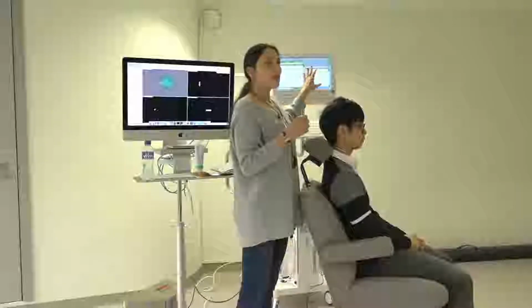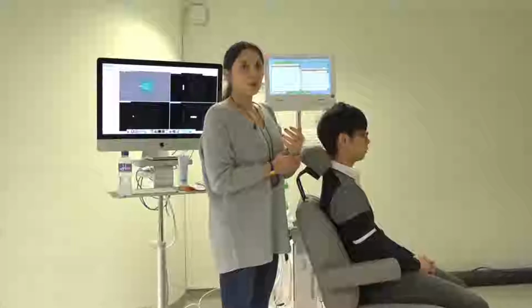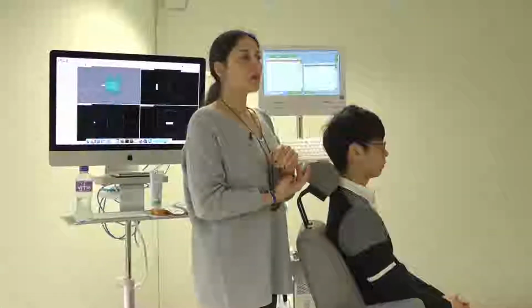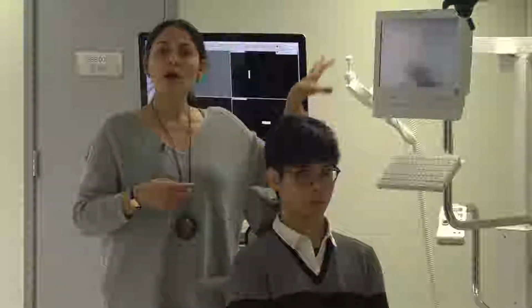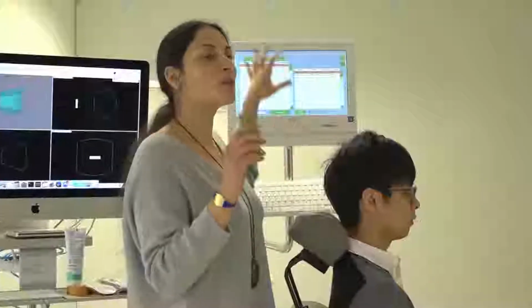But okay, this is very modern, so we will talk tomorrow about how you program this. I think you already have classes about this, and the idea is that I teach you how to do the technique, but also how to do some programming. I don't like programming, so it's how to program the machine.